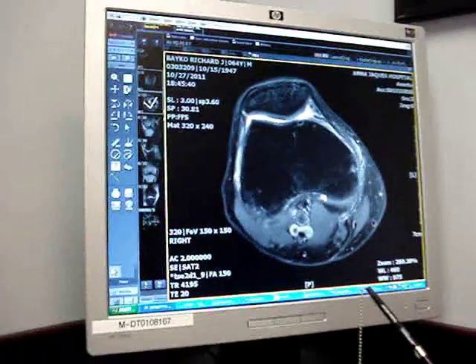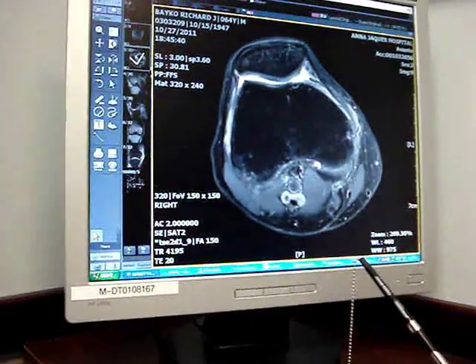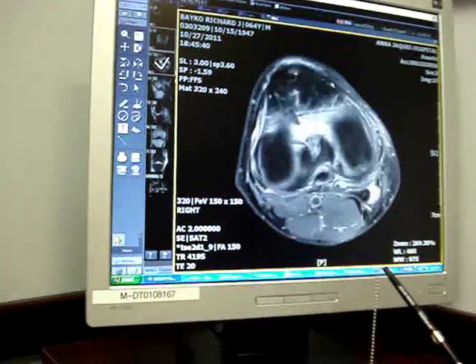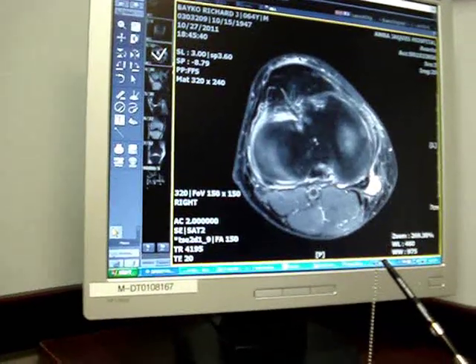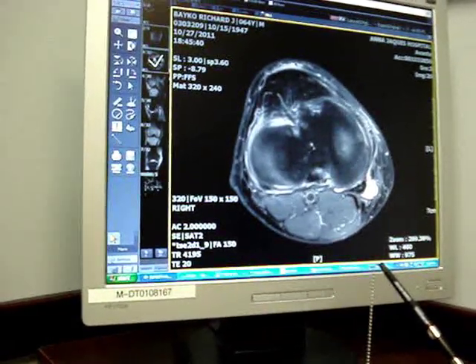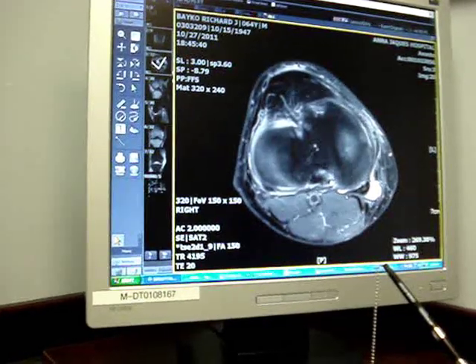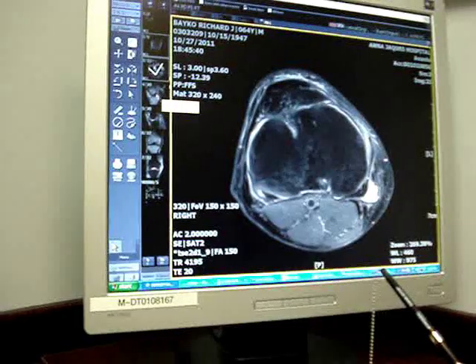If you look at the cartilage, the cartilage is the gray — a little indent — it might be some mild arthritic changes on your kneecap, nothing horrible. That's a cyst behind your knee, not a problem in and of itself, but it tells you there's something wrong in the knee. It's like a little balloon that pops out the back, but nothing to be concerned about.